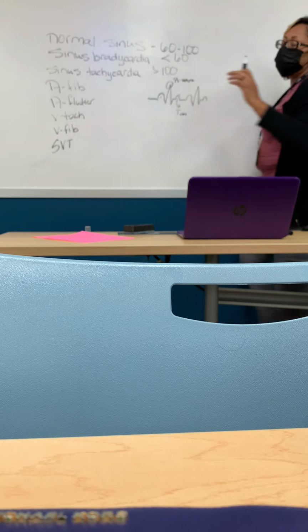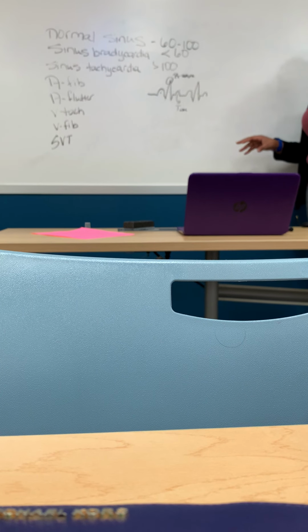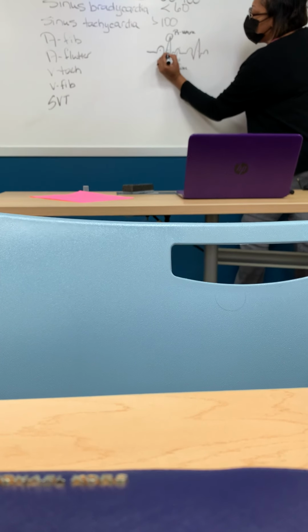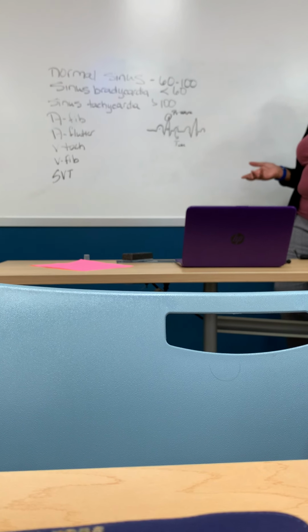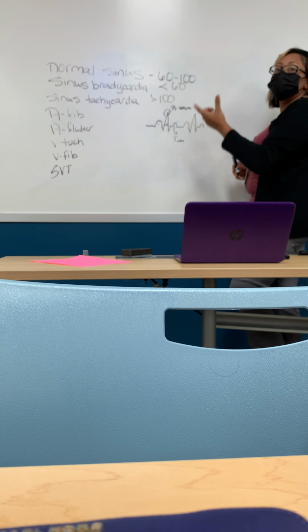So we're not gonna learn about counting, none of that. I don't want y'all to know the measurements. You'll get that in the EKG class. I just need you to know what looks normal and what does not. This should be narrow. If you look at those strips, they have little small boxes. This should be less than 2 small boxes. You don't have to measure it, you just look to make sure it's skinny. When it starts to look wider, there's something wrong.